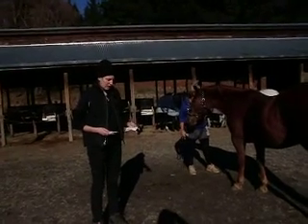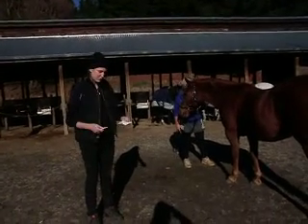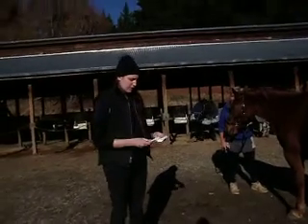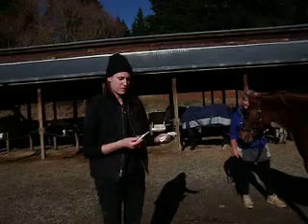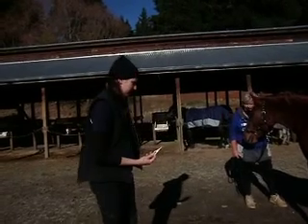I'm going to take Wren's temperature. I have a swab here with some lubricant in it and my thermometer. I'm going to twist the lube onto the end of the thermometer so I'm ready to go before I go near Wren.